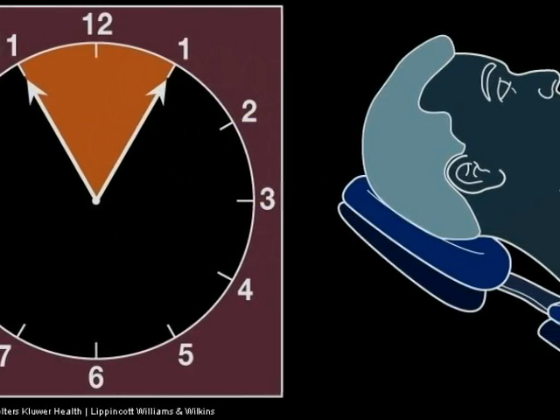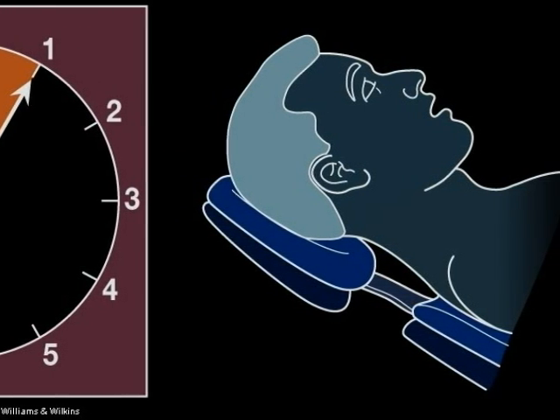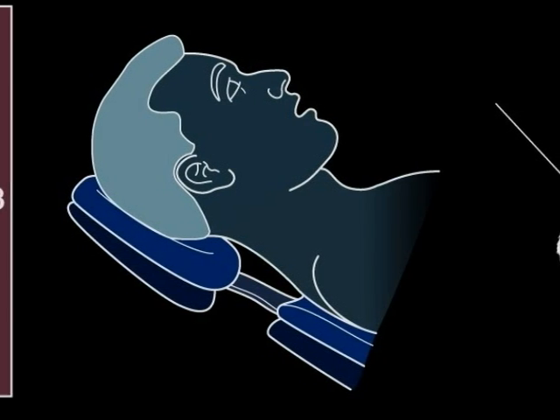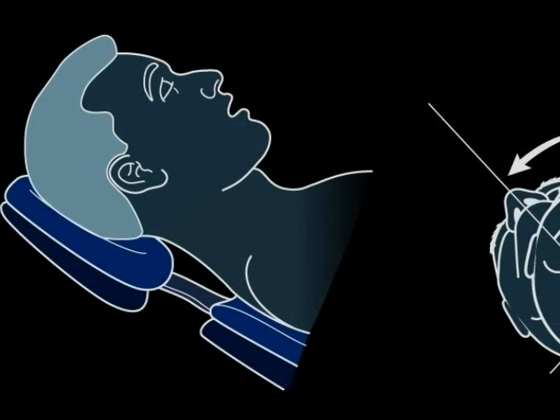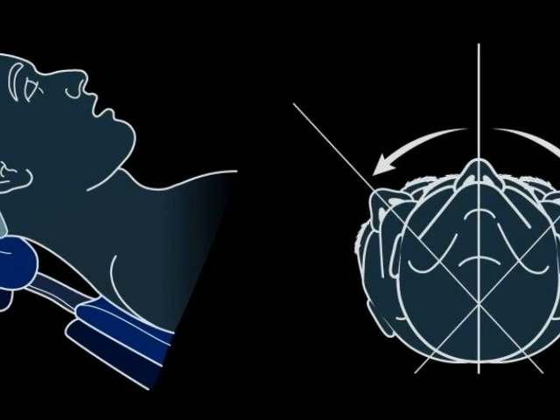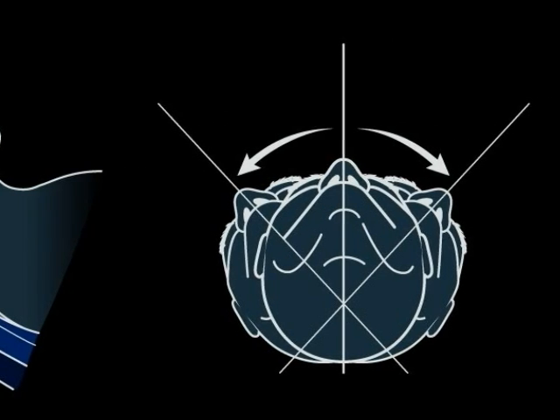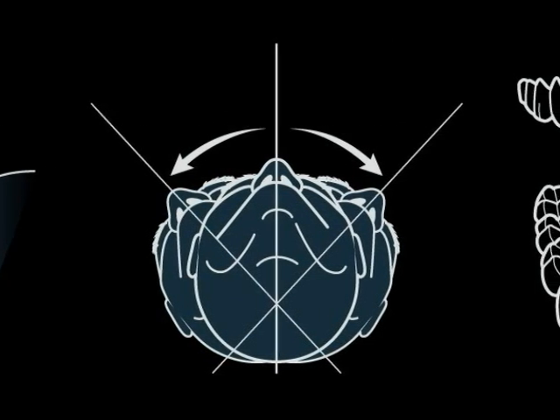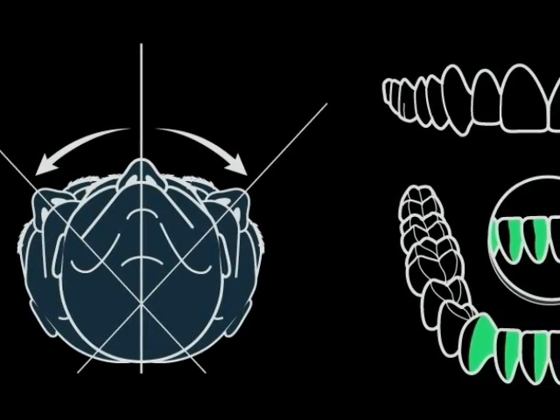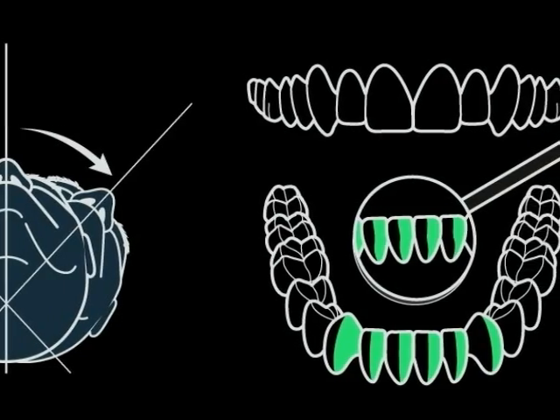Now for the mandibular anterior teeth surfaces away from the operator. The operator will sit from 11 to 12 o'clock and towards 1 o'clock if needed. The patient's chin is tilted down. Their head can rotate side to side. This position will allow for the operator to sit ergonomically correct for the lower mandibular anterior teeth surfaces away.